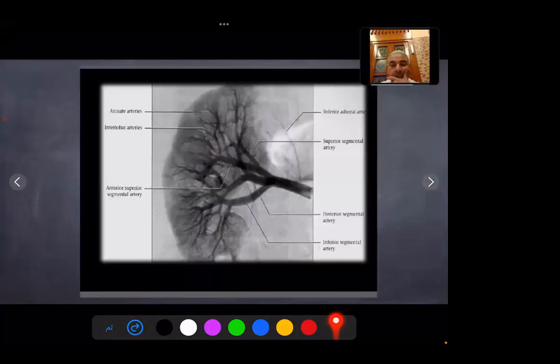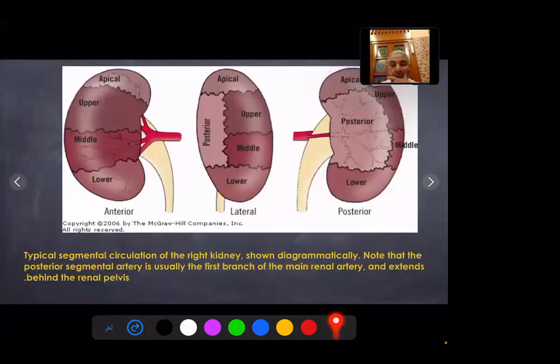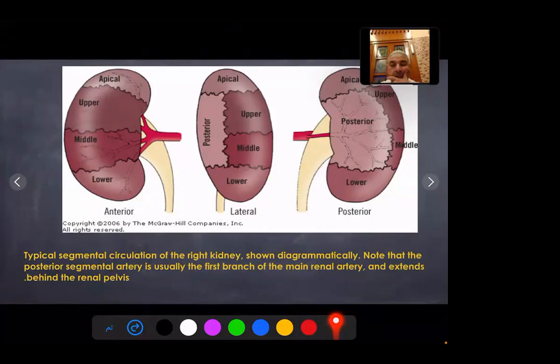This is a renal arteriogram showing the main renal artery, the segmental branches, the interlobar branches, and arcuate vessels. Typical segmental circulation of the right kidney: the first branch is the posterior segmental branch, which passes posterior to the renal pelvis and supplies the posterior and apical segment, while the other branches — apical, upper, middle, lower — supply the anterior surface of the kidney and variable portions of the apex and lower surface.